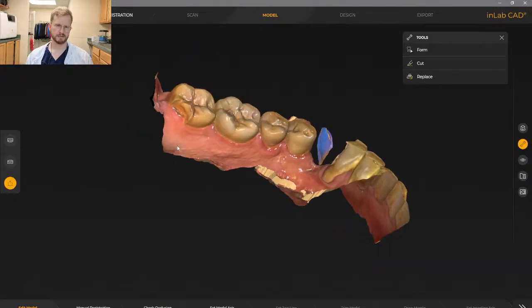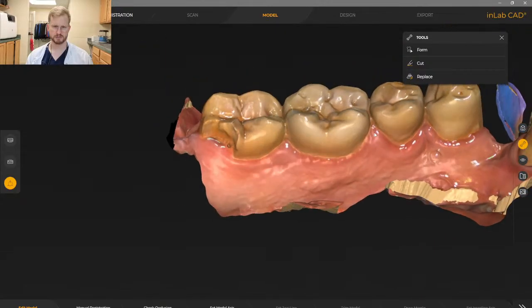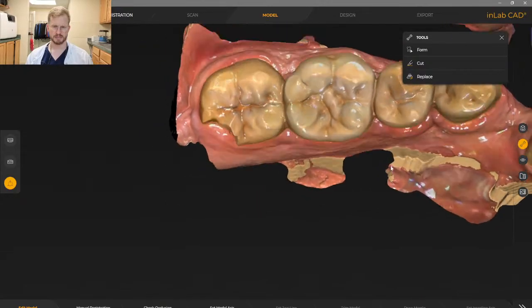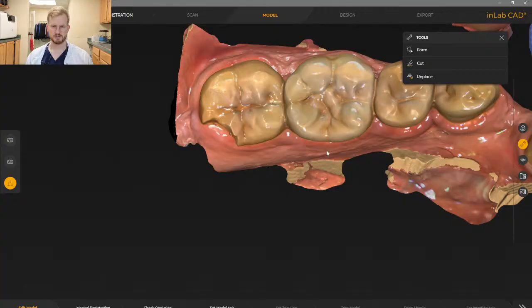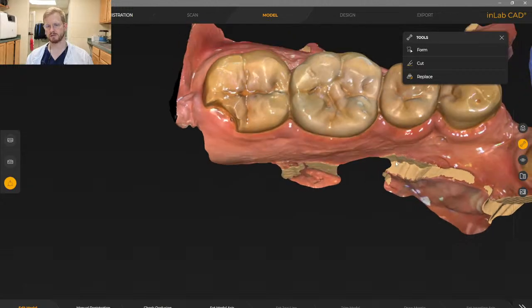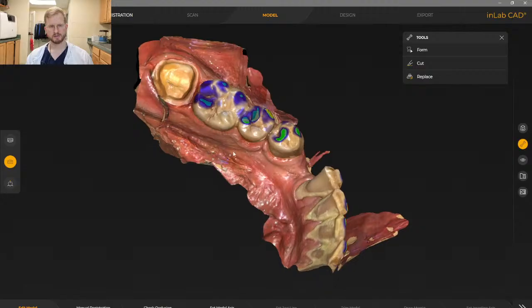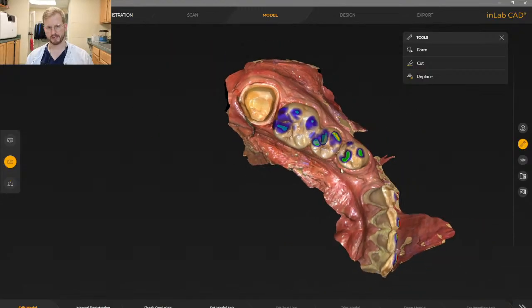Tooth number 18, this is how patient presents. So you can see that distal lingual cusp is clearly fractured. Patient decided he enjoyed that cusp to chew with. So of course, bonding a resin won't really help. It would just come out. So we wrap the tooth with the crown. Here's our crown prep. So we'll look more at that in a minute.